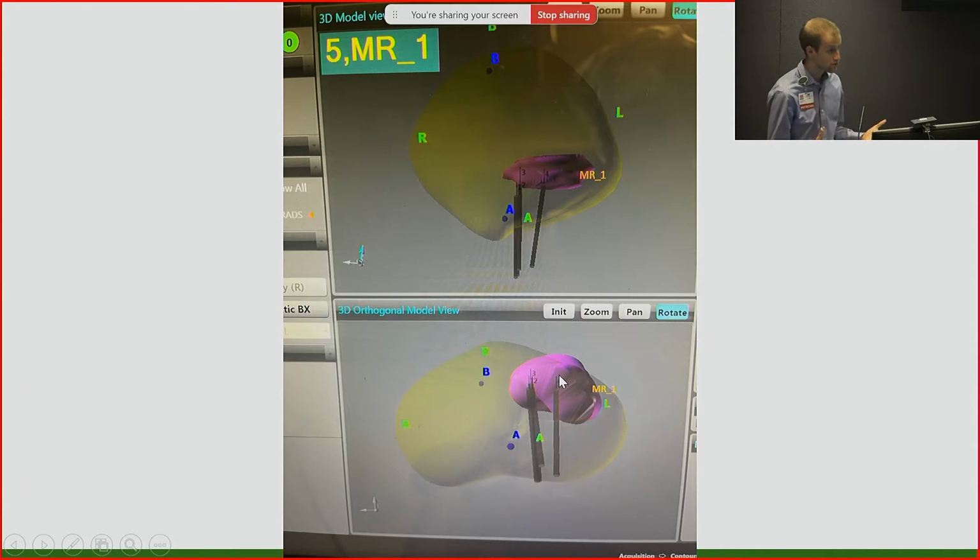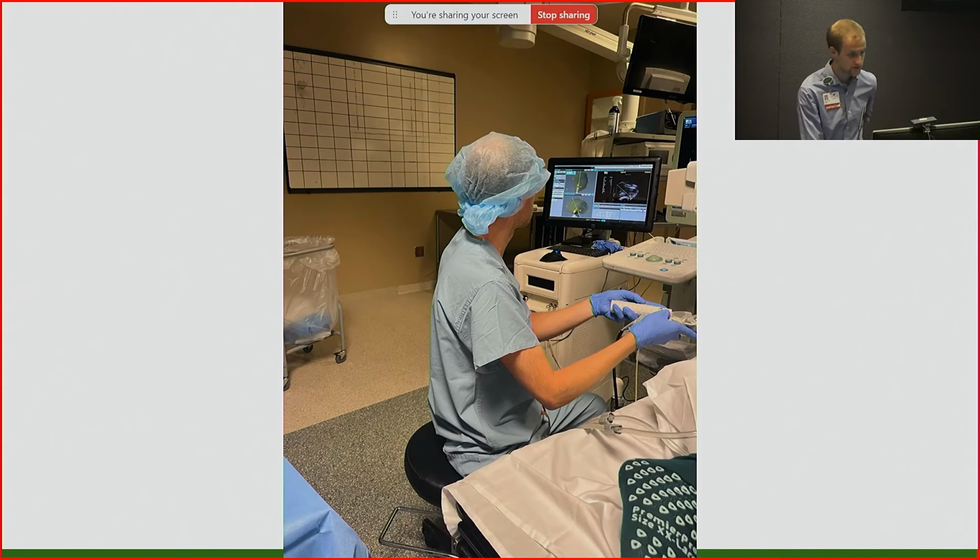So these are probably the most beneficial targeted biopsies, the one where you absolutely would not have caught it. We'll look through some cases later, some of which are super beneficial to have the targeting ability. Some are less beneficial, but this is certainly one that's helpful. So that's just a look at the after you take these cores, the system registered exactly where your cores have gone, and so you can see based on where everything was located, how you hit or did not hit the region of interest and of suspicion.